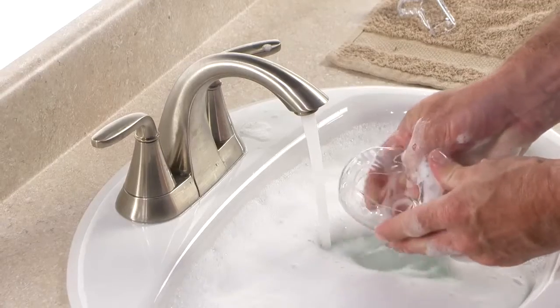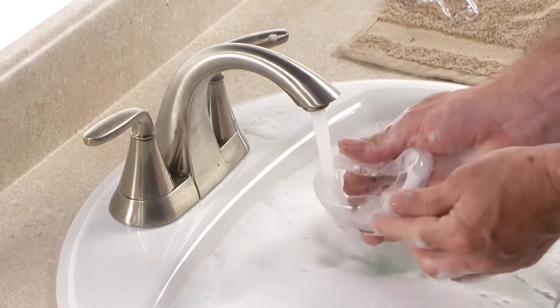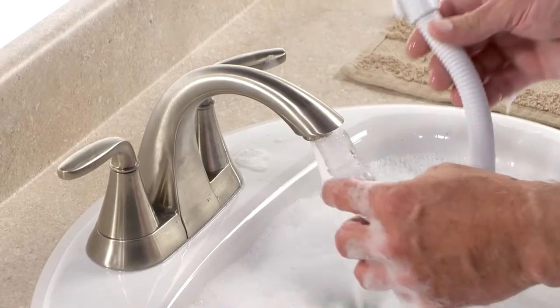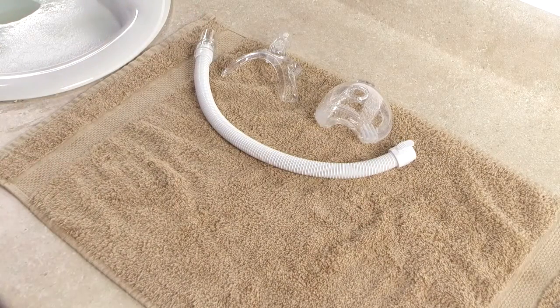Do not use bleach, alcohol, or cleaning solutions containing bleach, alcohol, conditioners, or moisturizers to clean your mask. Rinse the parts thoroughly with water and air dry completely. Be sure the mask and tubing are dry before use.